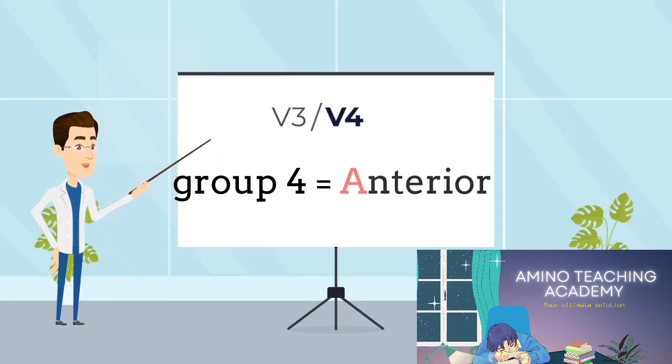Group 4 includes V3 and V4. They correspond to letter A, which stands for anterior. So ST segment elevation in these leads corresponds to myocardial infarction in the anterior wall of the heart.